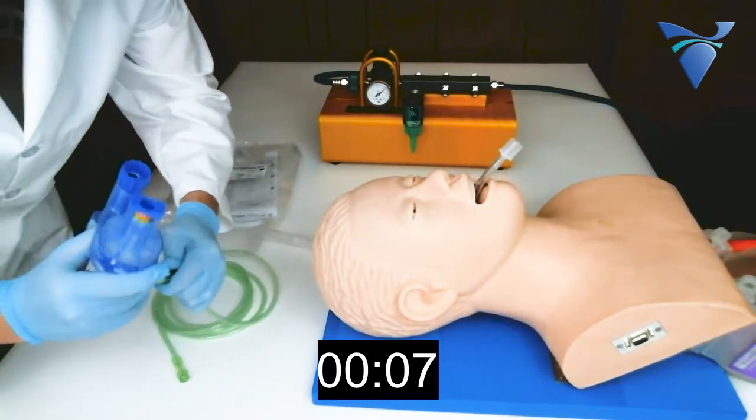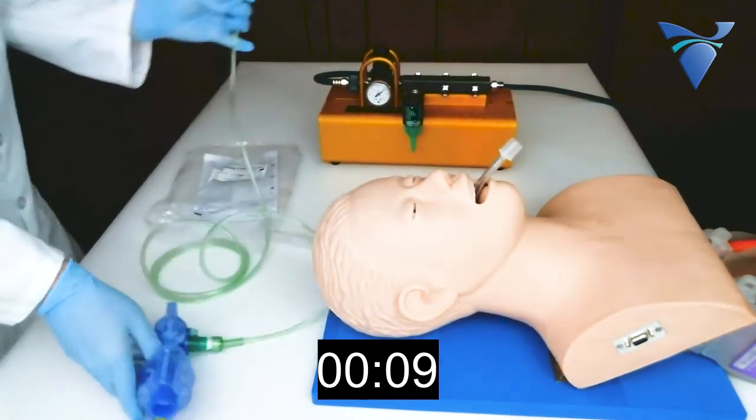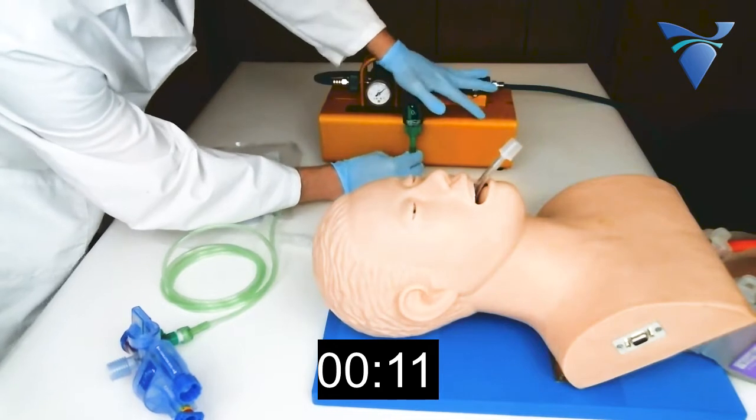The oxygen tubing is then connected to the GoToVent and oxygen source, and the flow is initiated on the flow meter.